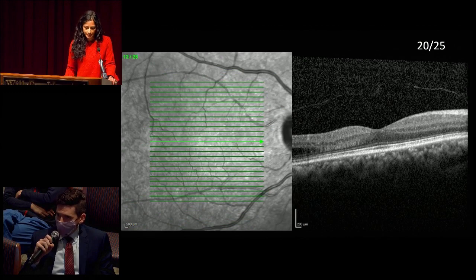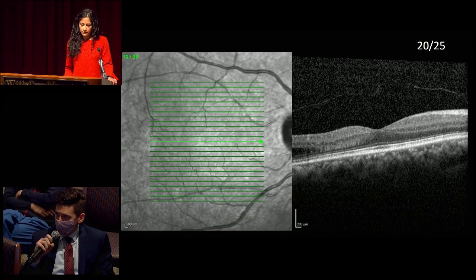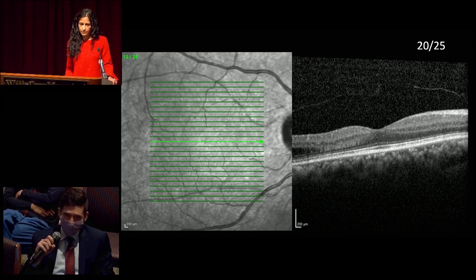In the right eye on the macular horizontal raster OCT, the premacular bursa is nicely visible with the posterior hyaloid. Retinal lamination patterns appear quite normal nasally. Interestingly, temporally there is loss of the ONL and OPL area, and there may be some schisis change.